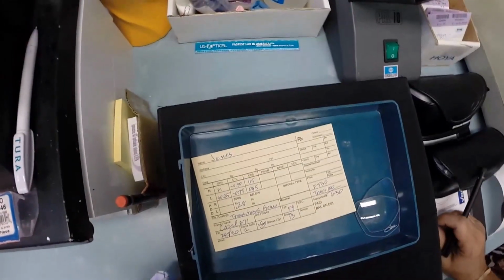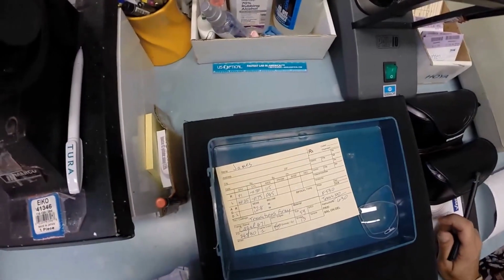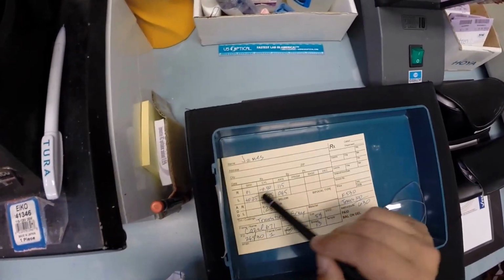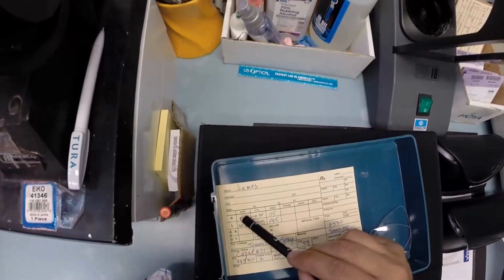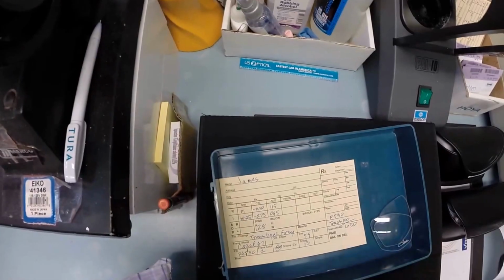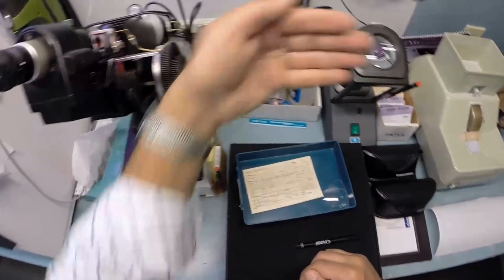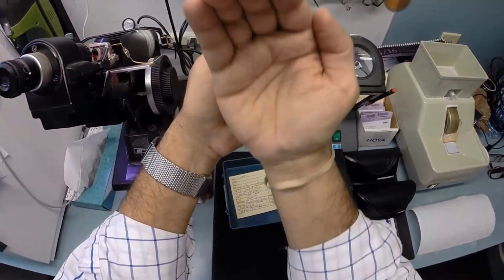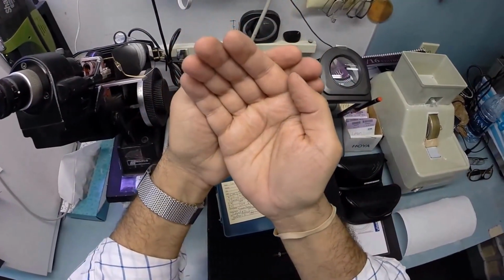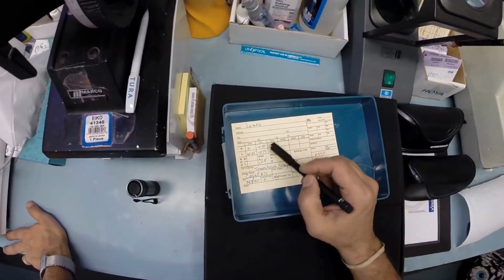The unit of measurement we use in the optical world is called a diopter, spelled D-I-O-P-T-E-R. It starts at a 0, which we in the industry call plano. It goes up from there, 0.25, 0.50, 0.75, 1, and so on. You've got them all represented here. How about that? So plano means no power, but you do have 2 steps of astigmatism correction. There is a stigma over the word astigmatism. It just means shape. You have 2 curves on your eyes. One curve going this way, which is non-prescription, a second curve this way, which is 2 steps steeper than this curve. And that 115 is how we line those curves up that make everything nice and crisp. Astigmatism is what makes 6s and 8s look alike, or the letters P and F. So it is the fine-tune knob.